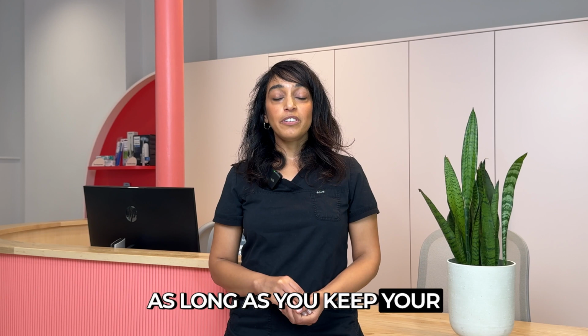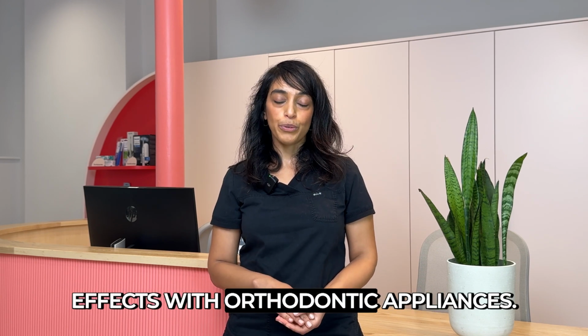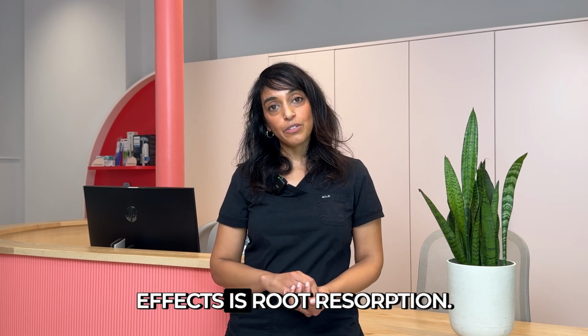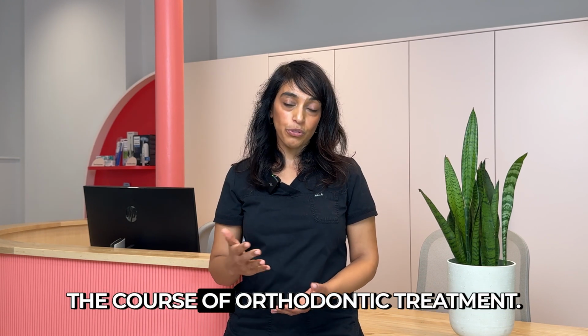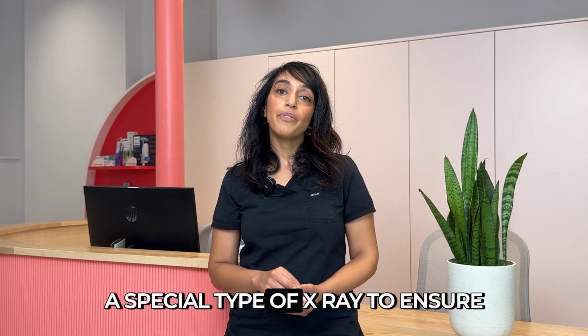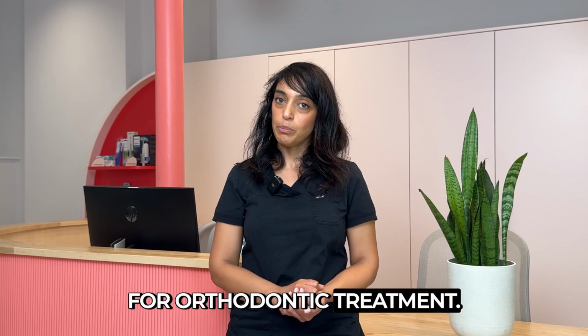As long as you keep your teeth healthy and clean, there are relatively few side effects with orthodontic appliances. However, one of the biggest side effects is root resorption. Root resorption is when the tip of the root melts away slightly during the course of orthodontic treatment. The orthodontist will take a special type of X-ray to ensure the suitability of your teeth for orthodontic treatment.